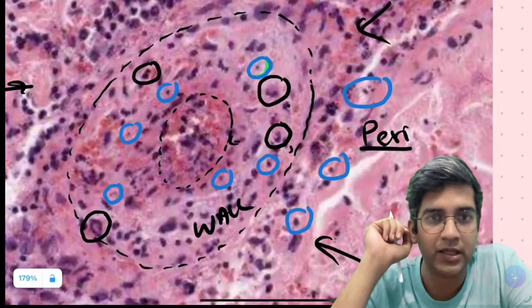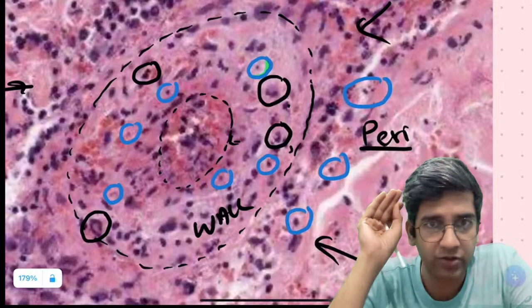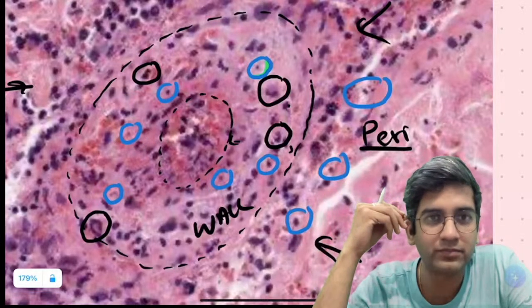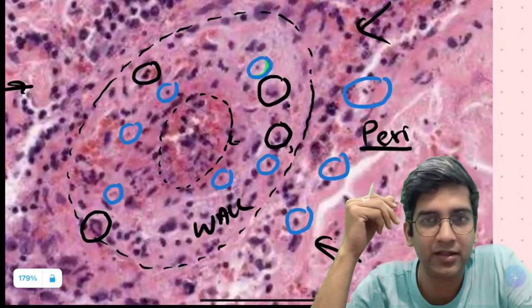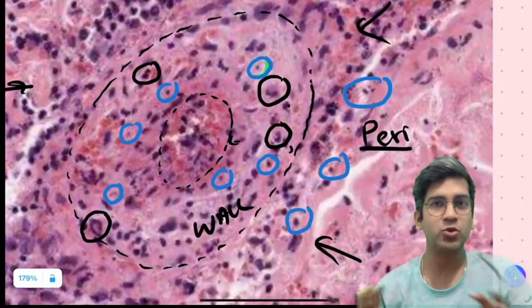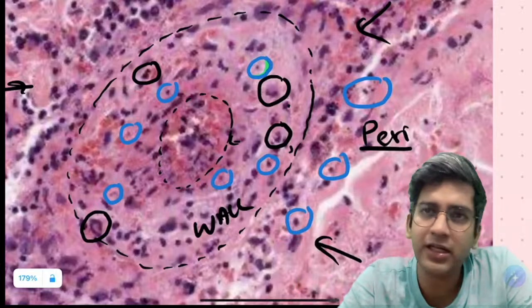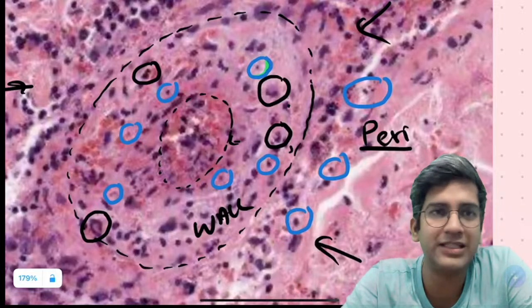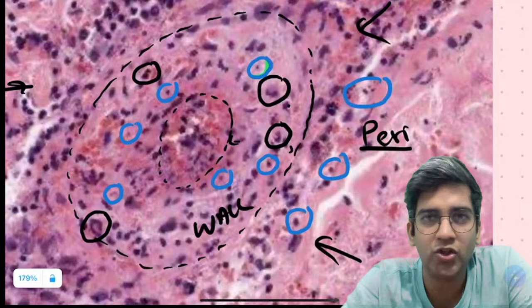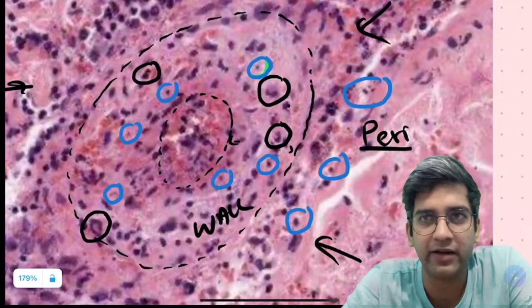Amazing, Hakim. Do you guys agree with Hakim's diagnosis that they are looking like a nuclear debris, looking like a nuclear material, right? Yes, no, maybe. Since Hakim has told us that it looks like a nuclear material, do you agree? Just a random question. You might agree it's looking like a nuclear material, right?